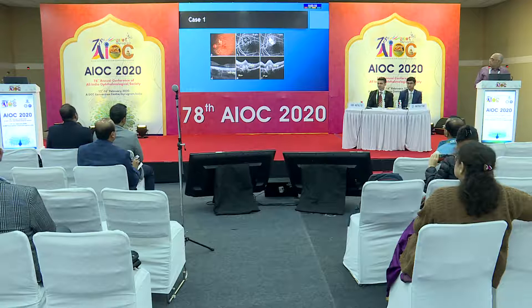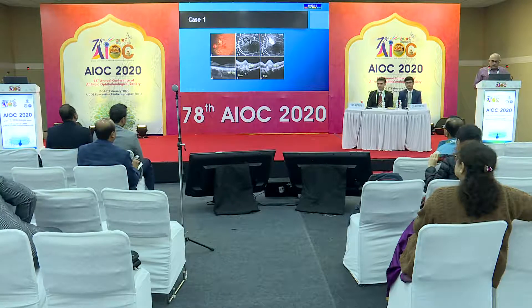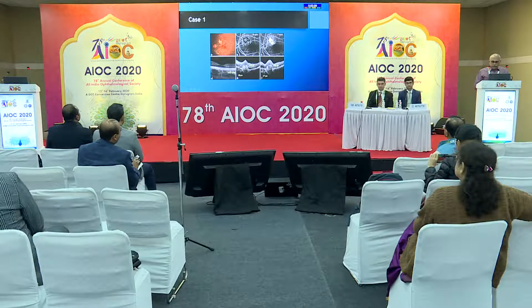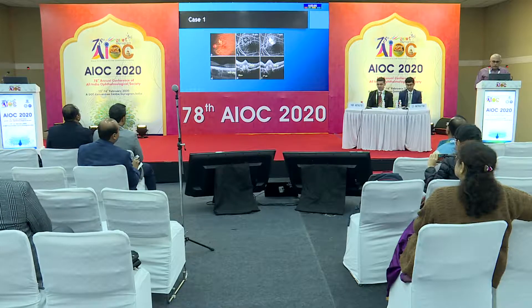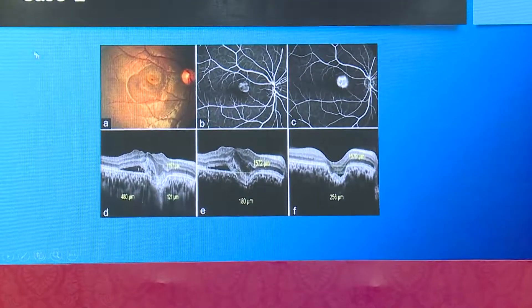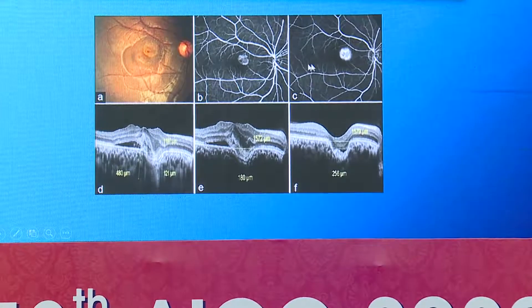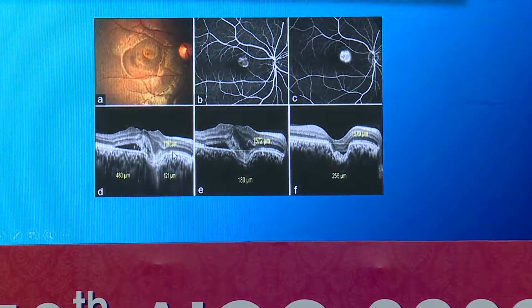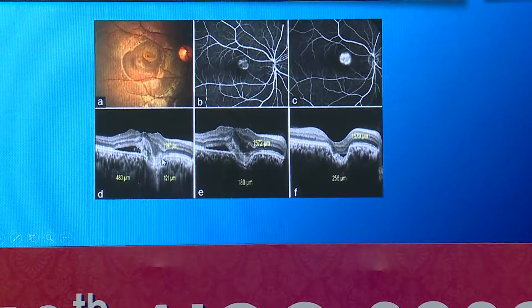Case one shows a classic choroidal neovascular membrane. Here is the focal choroidal excavation, which was present initially. This is before treatment and this is after treatment, where subretinal fluid has gone. So this is a case where CNVM has developed at the site of focal choroidal excavation. Case two shows another classic leaky pattern in the early phase with a foveal margin on angiogram. Here also, you can see focal choroidal excavation with subretinal fluid. This is before treatment, and after treatment the fluid has gone.